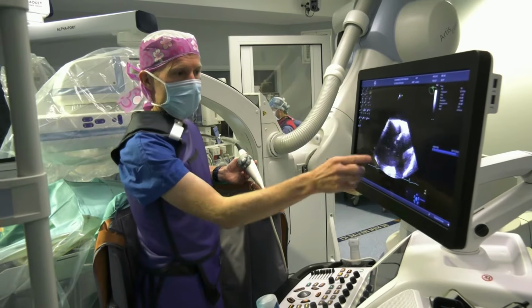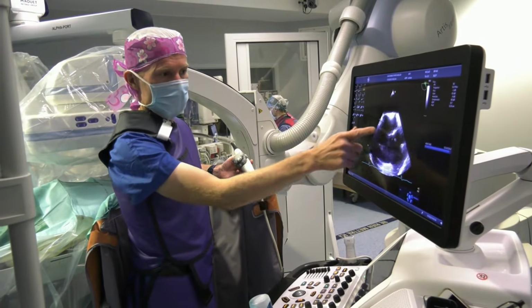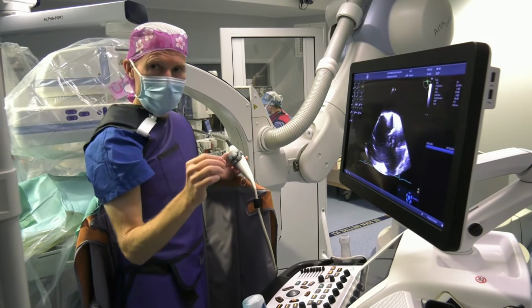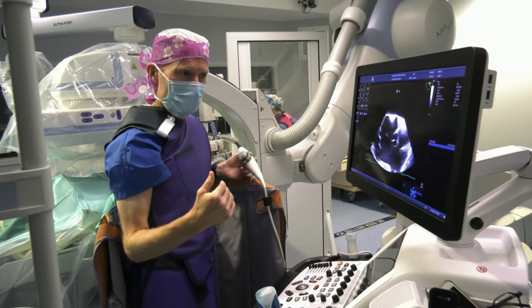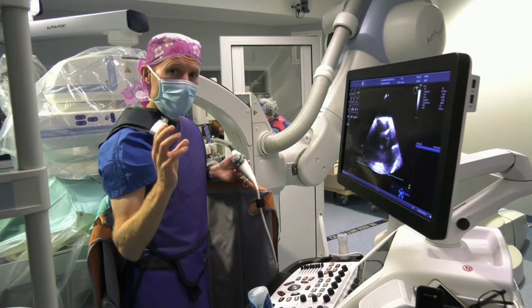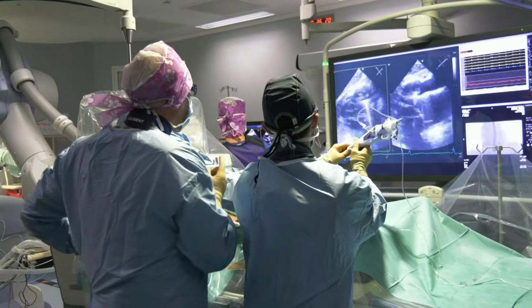So you see that we have in transesophageal view the tricuspid valve and the plane of the tricuspid annulus, and we will move the clip to make sure that we are in the middle of the valve, perpendicular to the plane of the tricuspid valve, and then we will be able to choose the location where we want to cross the valve, and then we will cross.